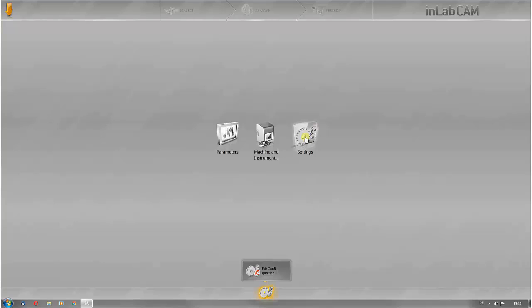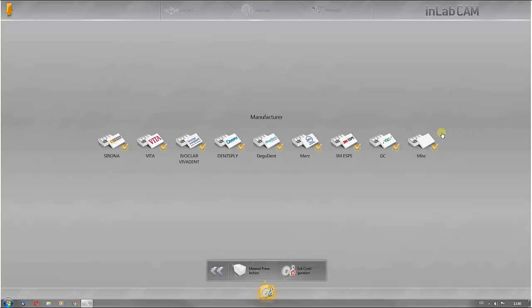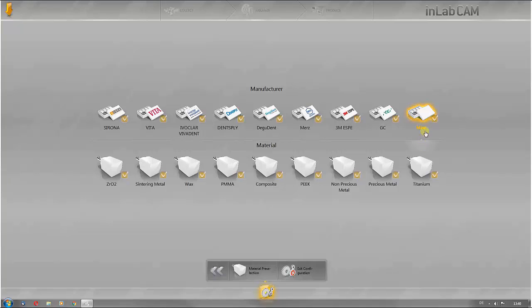The materials which are to be shown in the software can firstly be configured under settings. Here Sirona and certified material partners are specified separately. All other materials are summarized under the category MISC.